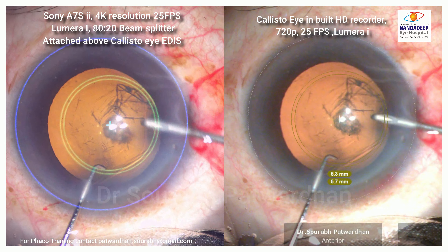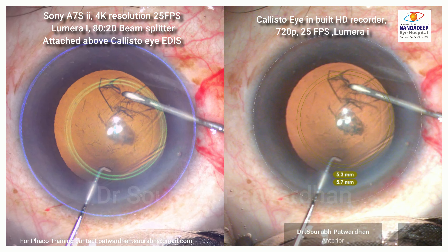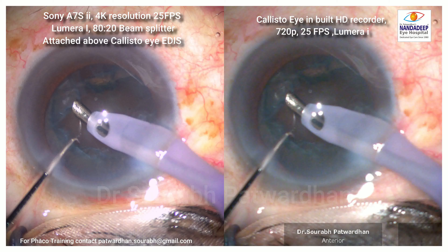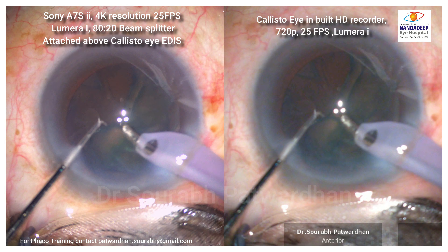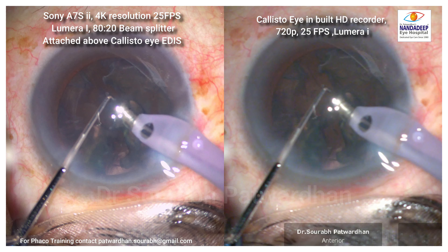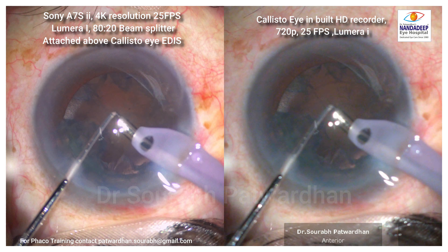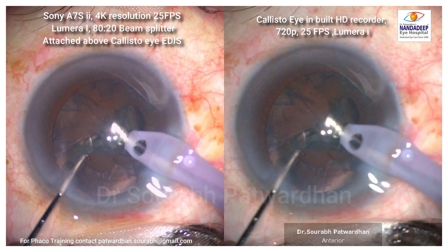On the right side, the Calistoi inbuilt recorder puts the overlay inside the software, so there is no latency seen there. Overall, the quality of the Calistoi HD recorder is quite good — it is usable, but definitely resolution-wise the 4K camera scores better.